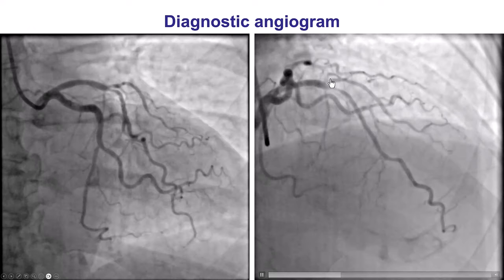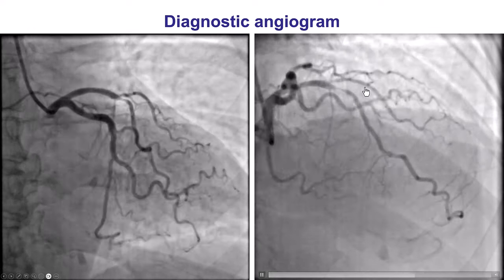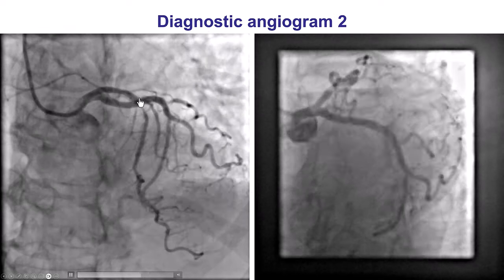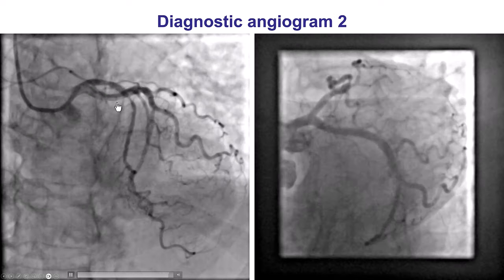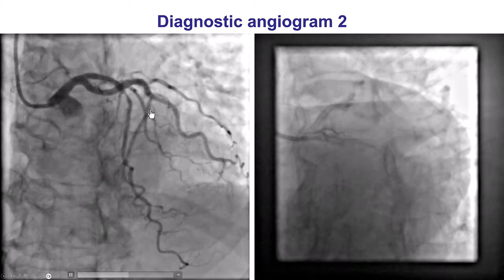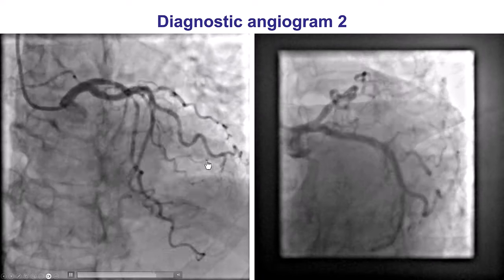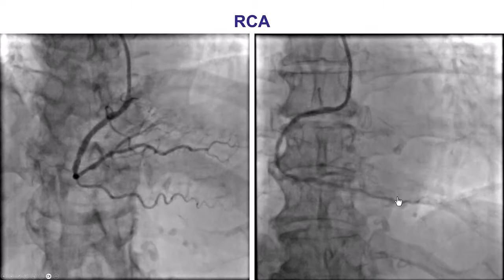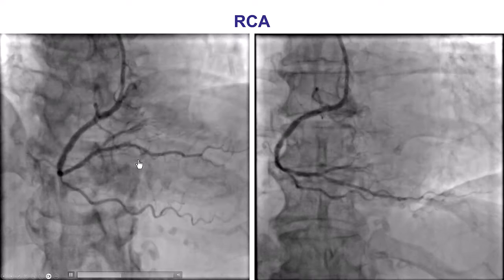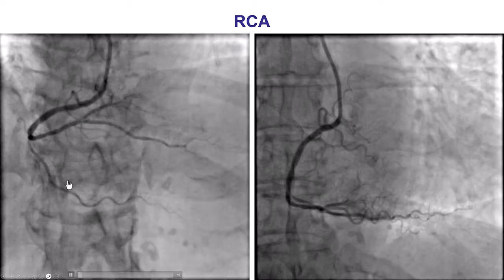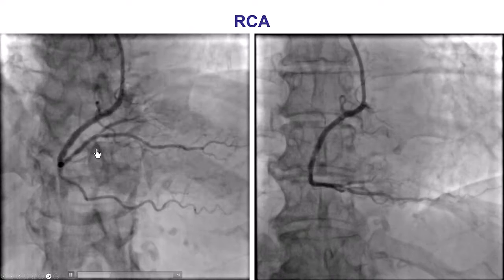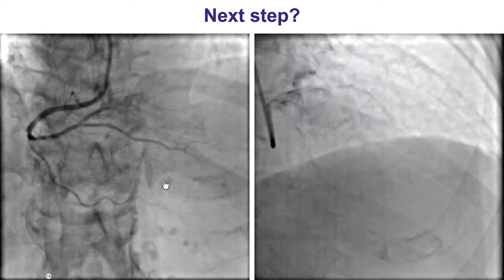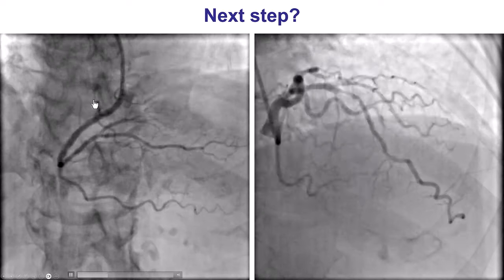However, there is some disease at the origin of the diagonal branch. In a different projection, again, we see disease in the LAD with some disease in the diagonal. The circumflex system is okay. In the RCA, there is also an intermediate lesion in the distal RCA at the ostium of the PDA. So, what to do next?